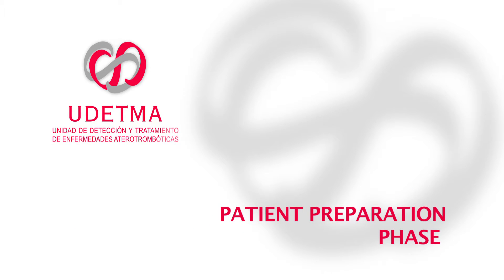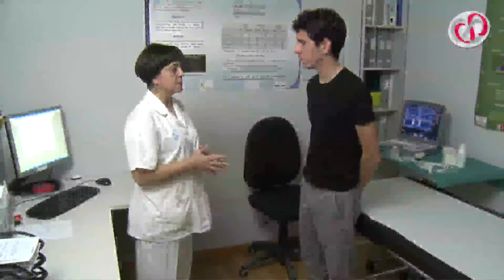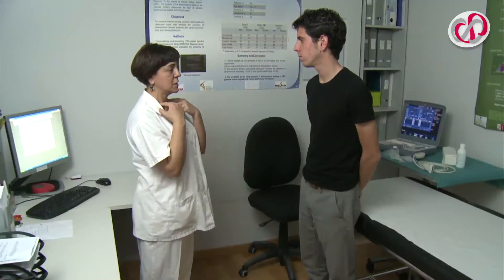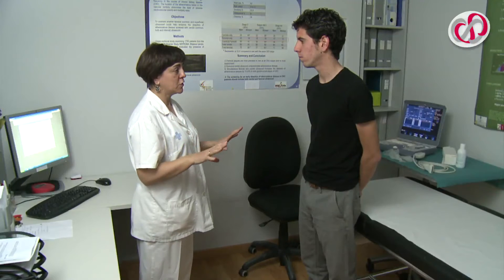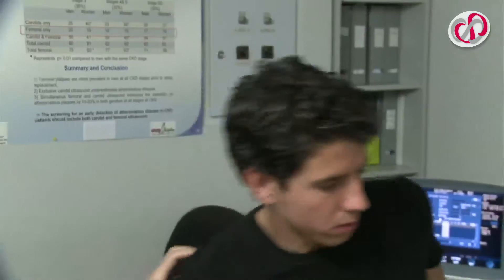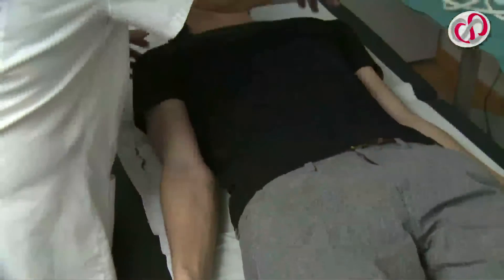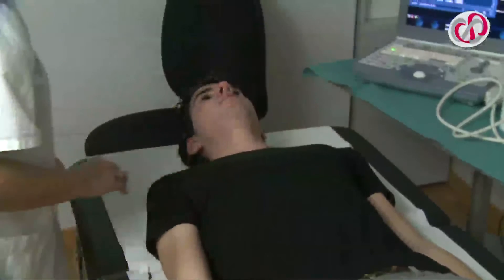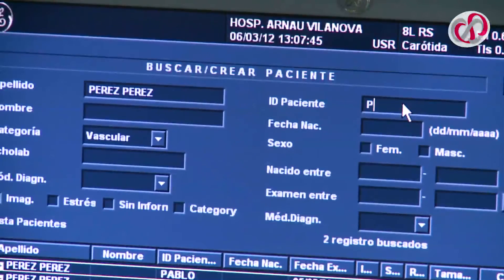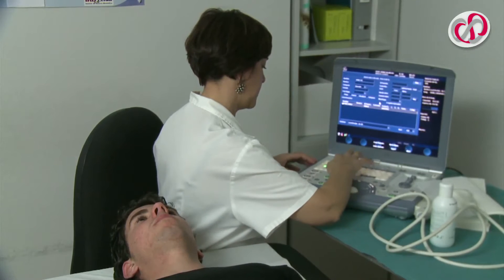Patient Preparation Phase: Firstly, we inform the patient of the exploration that will take place, and he or she lies in the supine position on the examining table with the headboard flat and with arms outstretched beside the body. We then introduce the patient's personal data into the ultrasound.